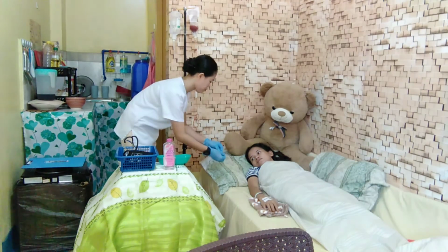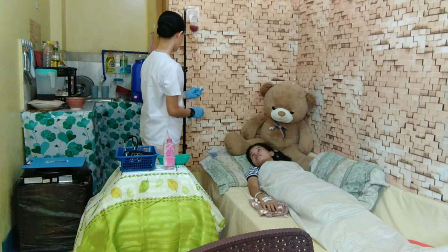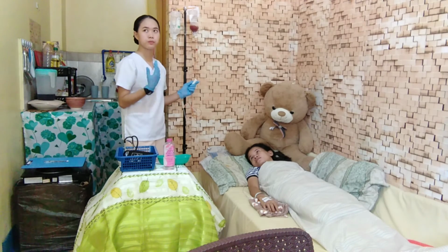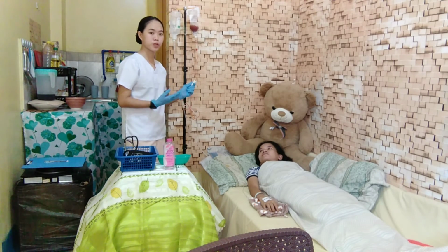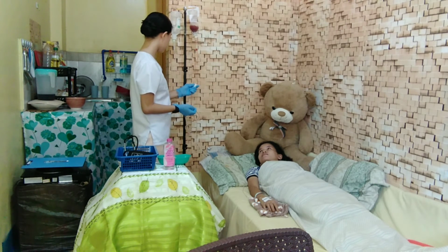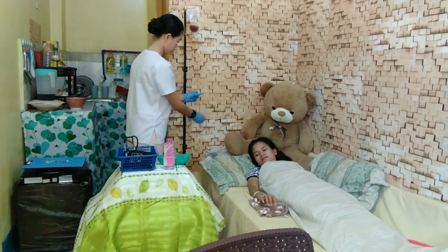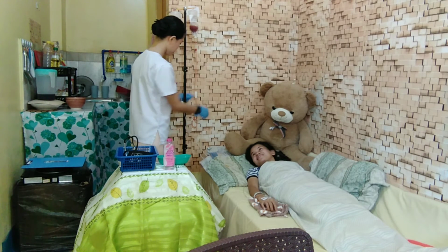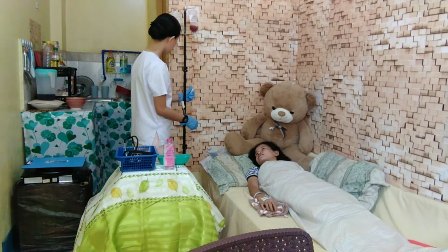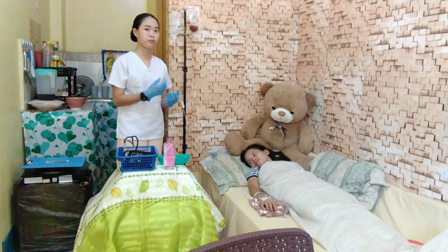Then we will adjust the roller clamp for the first 15 minutes, and adjust it to 30 drops per minute, and remain at the bedside of the patient for about 15 to 30 minutes.